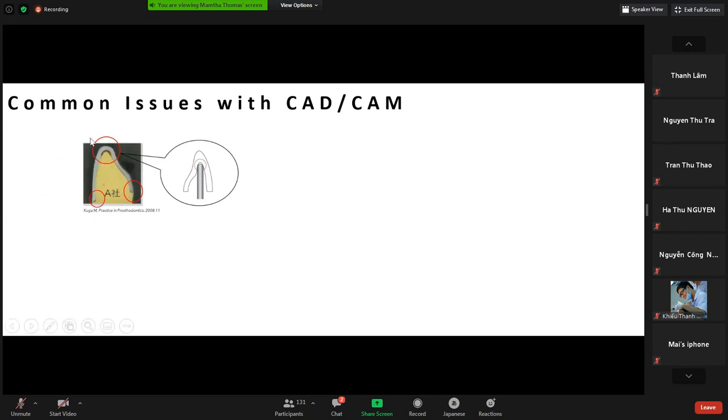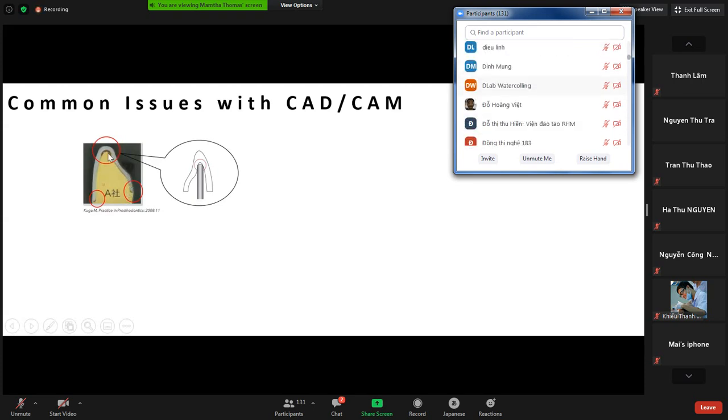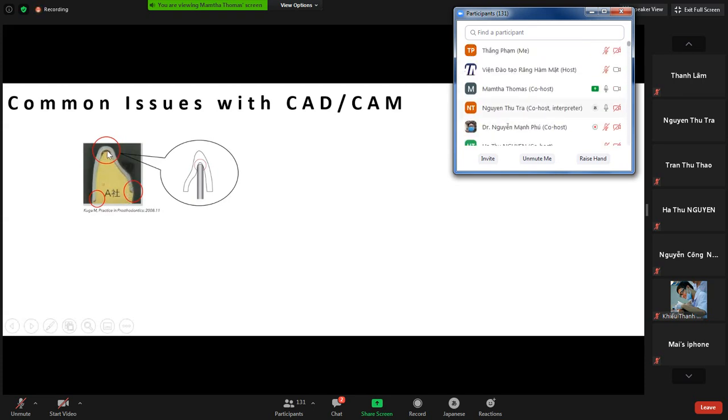So we end up actually putting excess cement in these areas. The layer of cement will be quite thick to accommodate for this shape difference.